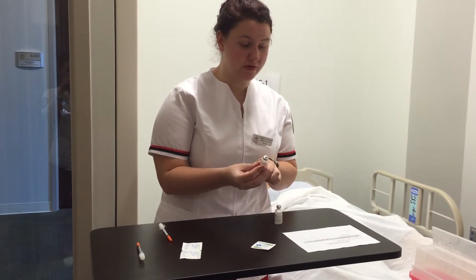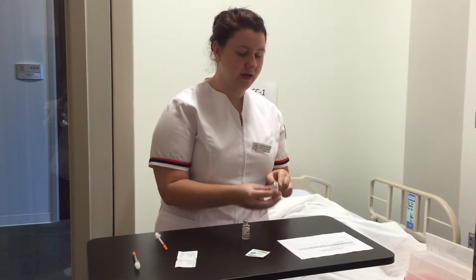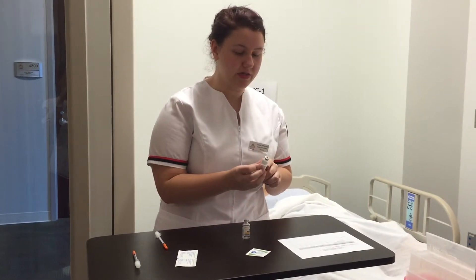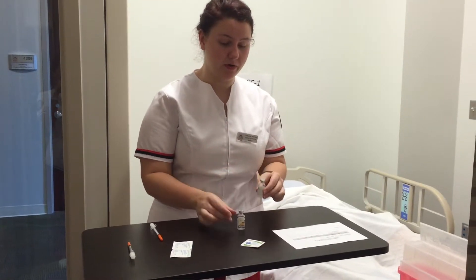Regular insulin 12 units — I have regular insulin and the vial has not expired. I have insulin NPH and it has not expired, and I have insulin NPH on my MAR.